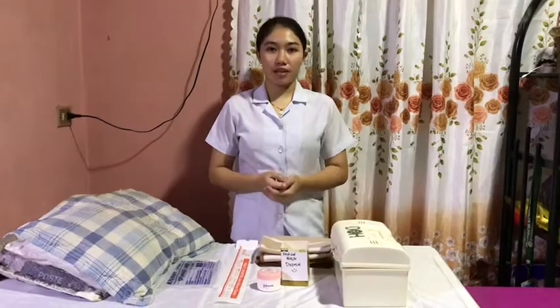Everyone. My name is Adil Zainal, a student nurse from Davao Doctors College. And today I'm going to perform female urinary catheterization return demonstration.